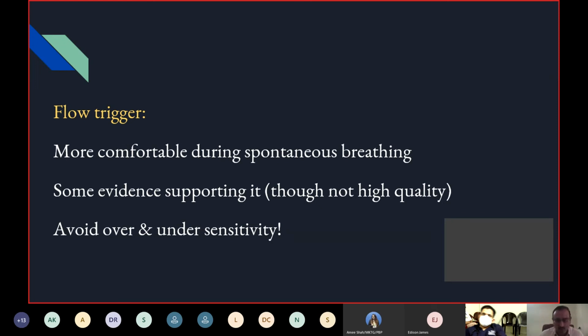So what do you mean by flow? What happens is, through the ventilator, there is a bias flow. That means a constant flow is going on, around 5 to 10 liters per minute. So that flow is going on.